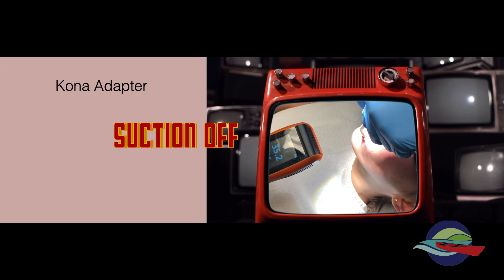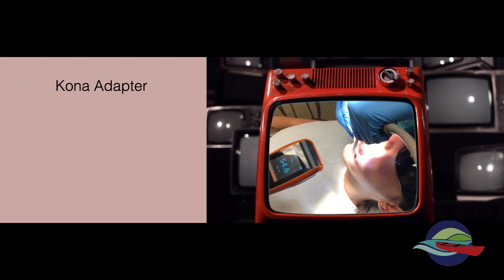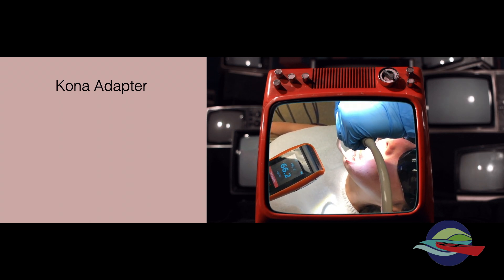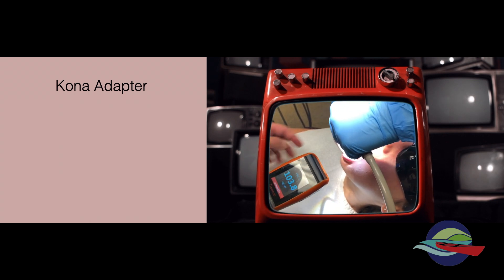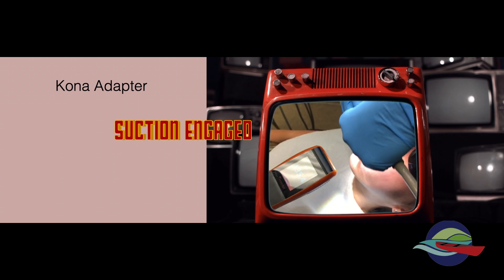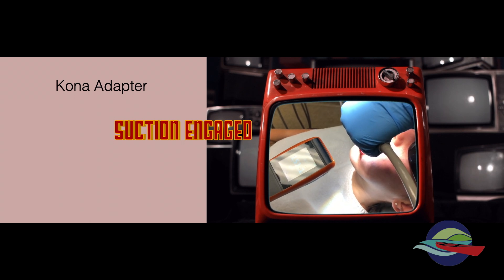We started with the suction off, and immediately we created high levels of detectable aerosol from the EMS powder. When the Kona Adapter high-volume suction is activated, the particles are rapidly reduced. The suction is really quite effective and powerful. The unit was very effective in the posterior areas, but the anterior area was a bit more challenging.